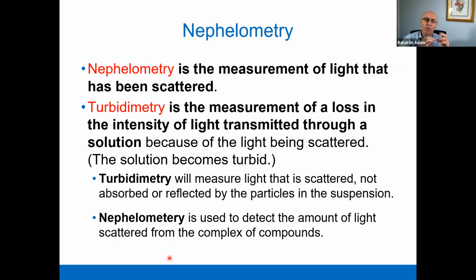And I am going to explain what complex or compound means, and how we are using nephelometry to measure the amount of antigen-antibody complex.